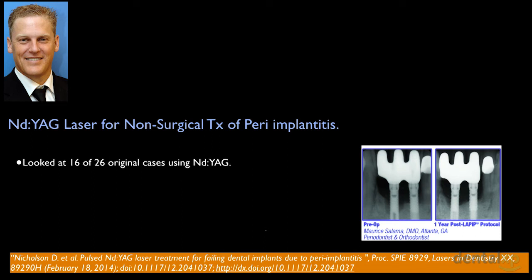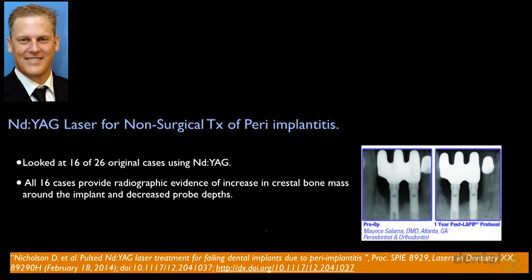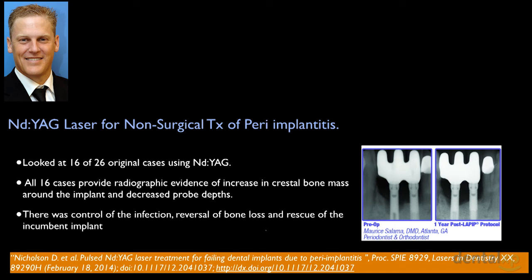Tomorrow, Dr. Stephen Brown is going to be focusing on the role of the Nd:YAG laser for something called LANAP. Dr. Dawn Nicholson and her group has looked at 26 cases, of which they focused on 16 final cases. As you can see here is the Salama brothers, Maurice's particular case. And what they found is that all of them showed an increase in crestal bone when using the Nd:YAG and decreased probing depths.